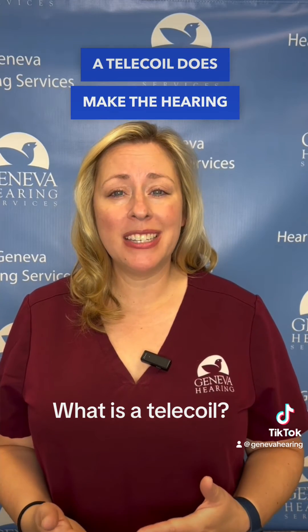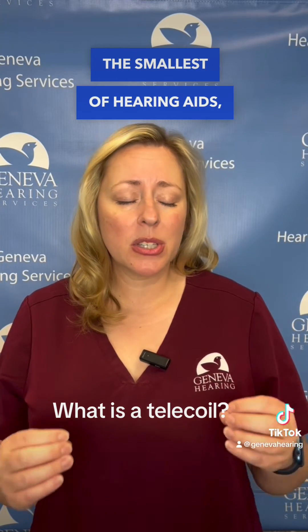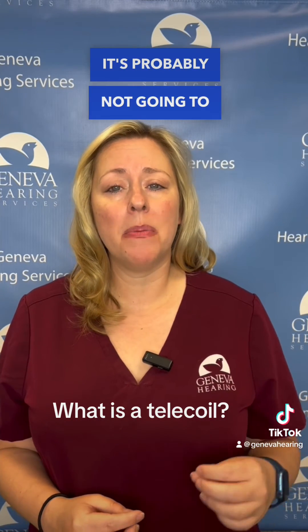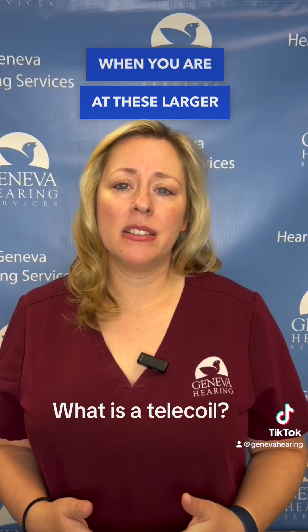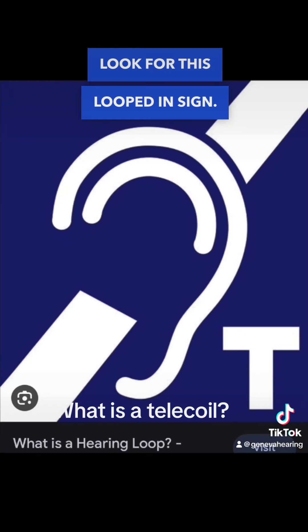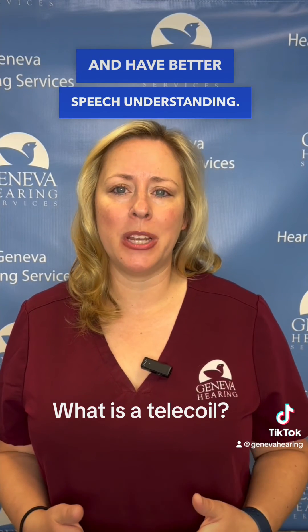Now, remember, a telecoil does make the hearing aid a little bit bigger. So if you're looking for the smallest of hearing aids, it's probably not going to have a telecoil in it. When you are at these larger venues, you want to look for this looped-in sign. That lets you know that the venue has a loop and you can activate the telecoil and have better speech understanding.